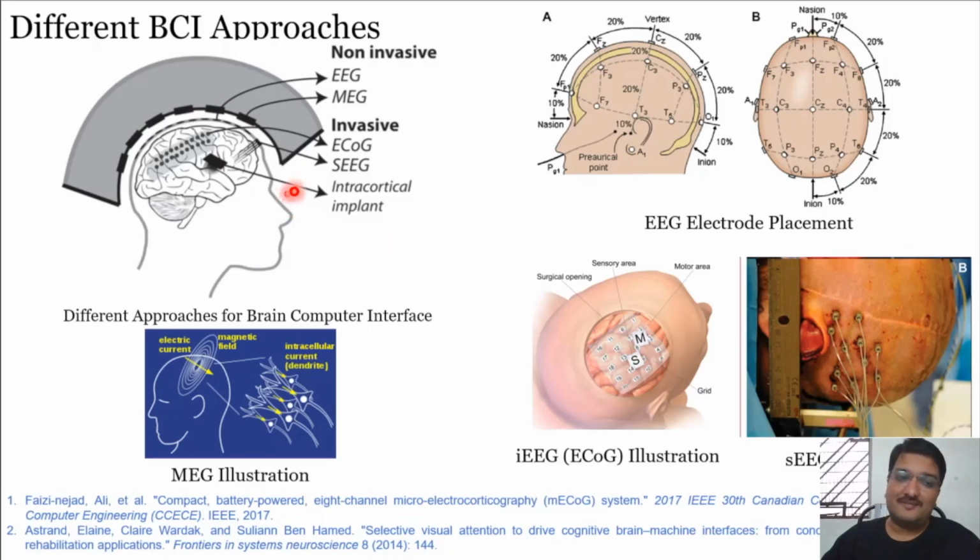Whereas, if you can place something like an intracortical implant made of bioresorbable material, a very important thing, that material should be bioresorbable. Otherwise, it might result in some form of infection, or it may damage some of the tissue, and as a result, you might lose your sensory system. So for implantation, when you go inside your body and put something, it should be biocompatible and bioresorbable.